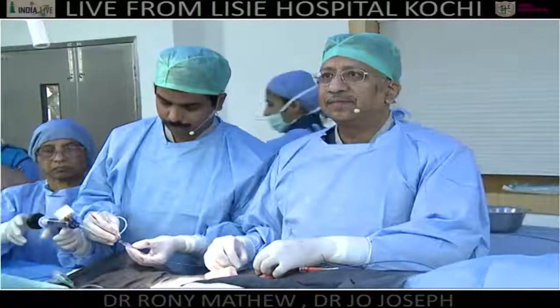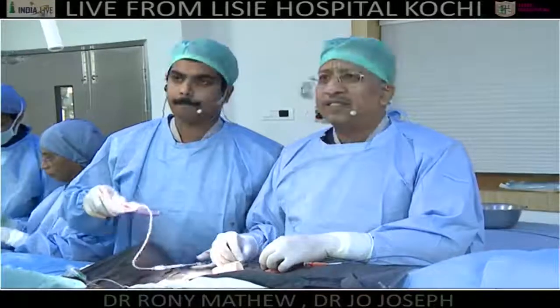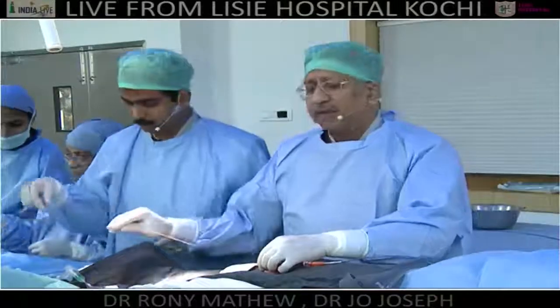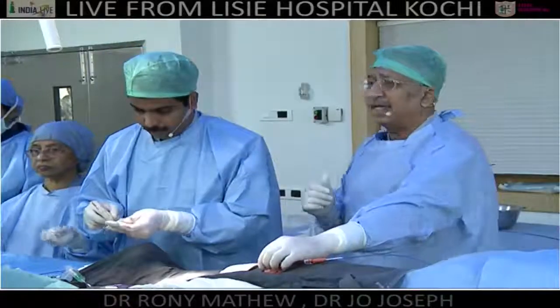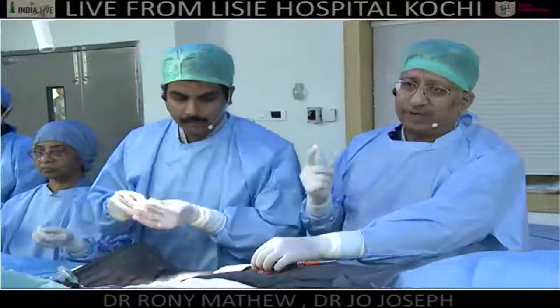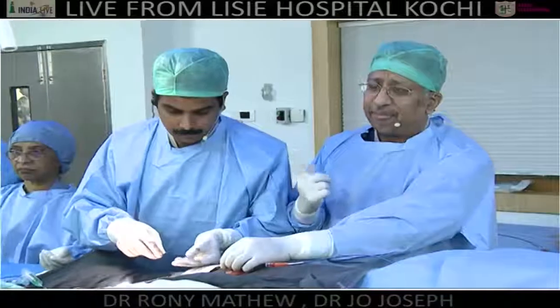That's a pretty difficult question to answer, Brian, but it's like this. Once you do OCT in some cases and you are sure what you are doing, you subsequently really do not need the OCT. But one of the important things in bifurcation that I realized is that OCT does tell you 2-3 things. One, it tells you the anatomy and pathology at that point.